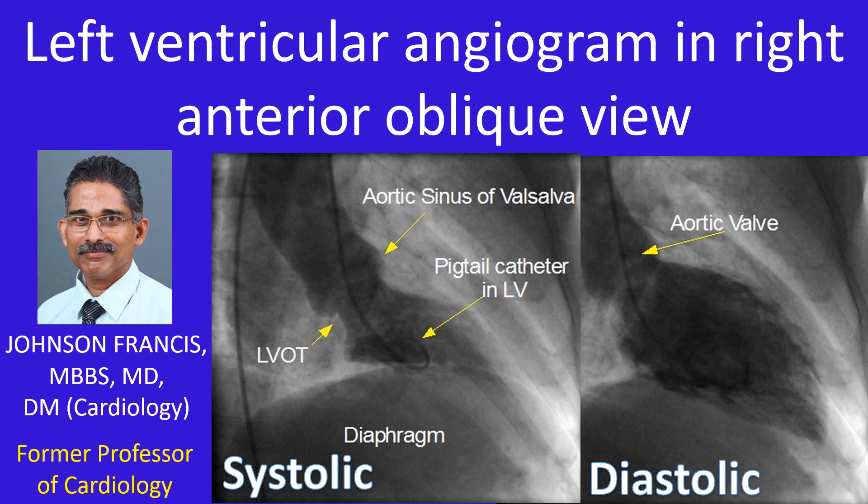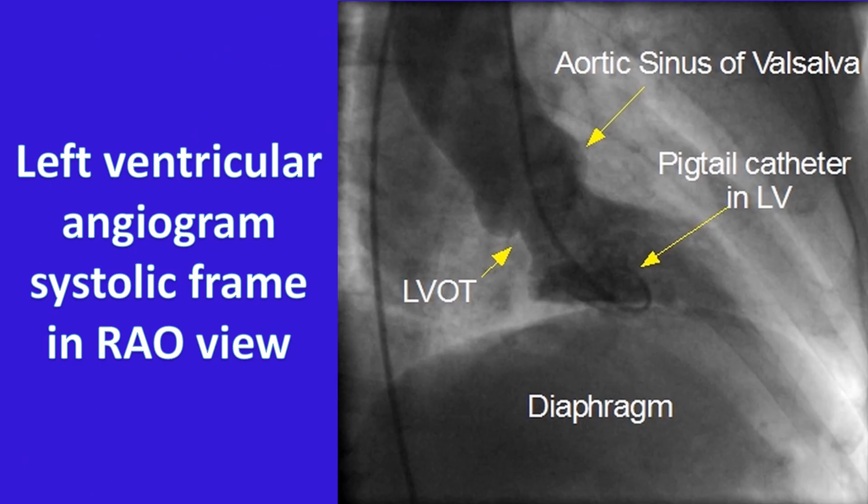This is a description of a left ventricular angiogram in the right anterior oblique view. Systolic and diastolic frames are shown in sequence. The pigtail catheter is seen in the left ventricular cavity.